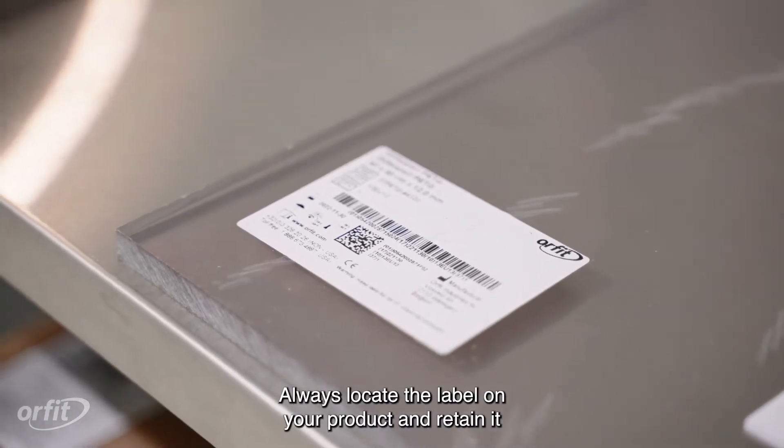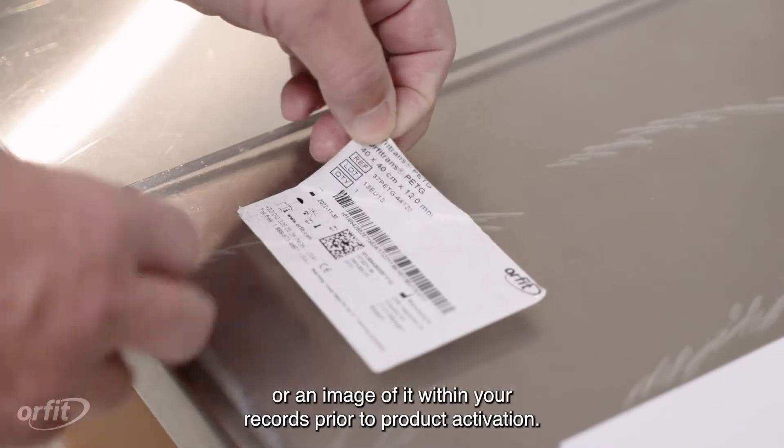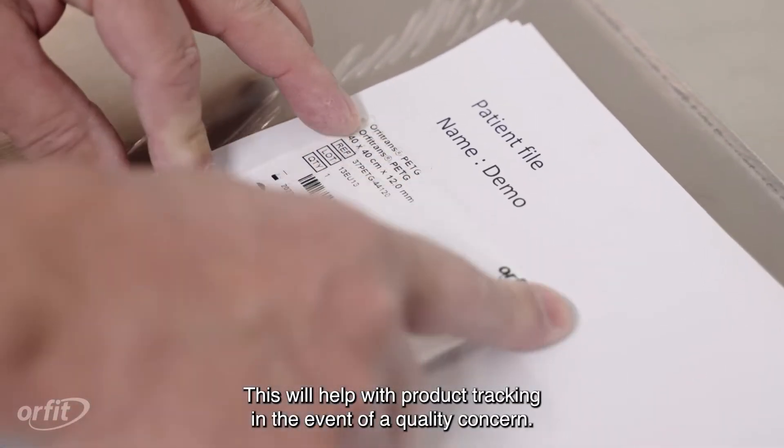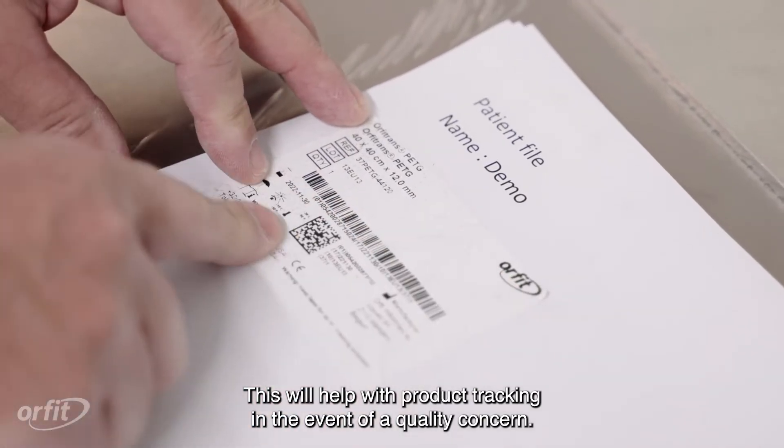Always locate the label on your product and retain it or an image of it within your records prior to product activation. This will help with product tracking in the event of a quality concern.